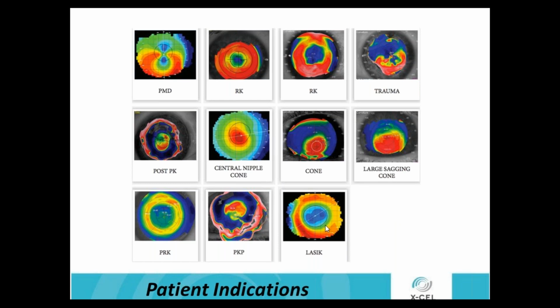We're really seeing an influx of LASIK patients. So post LASIK, 8 to 10 years out, they're coming back and they have 2 diopters of spectacle refractive cylinder, and they have this irregularity where they're flat centrally with a steep mid-peripheral area. So it is nice to use that scleral for all that irregularity.